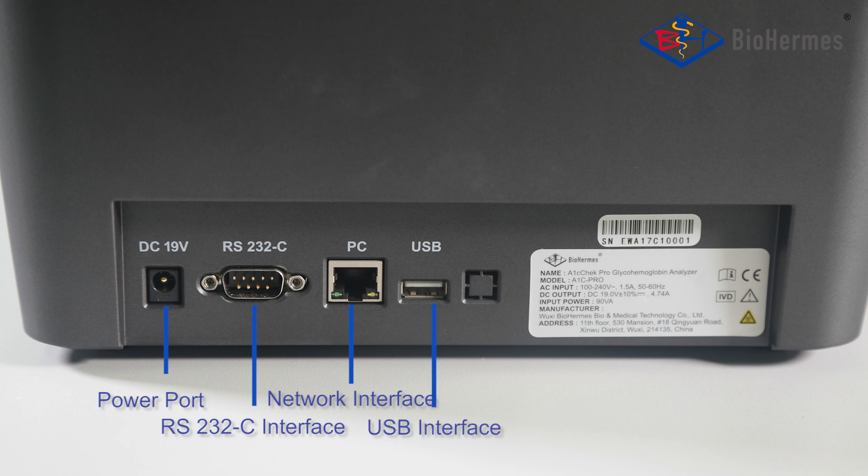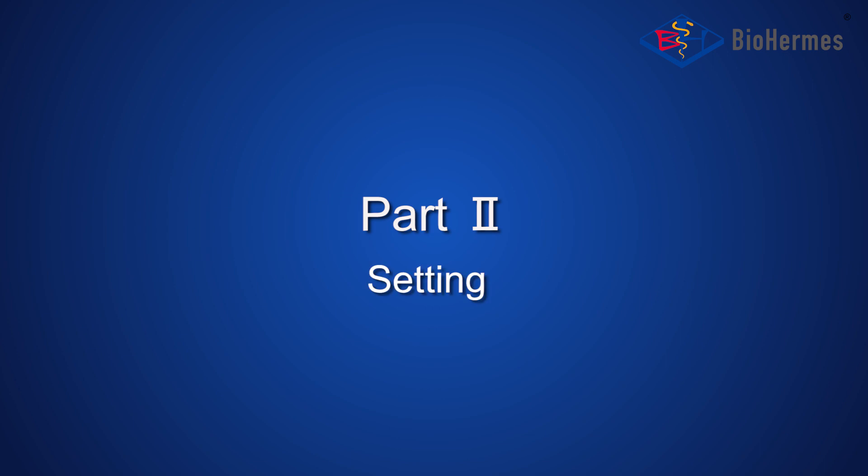The analyzer also features a USB Interface. Part 2: Setting.